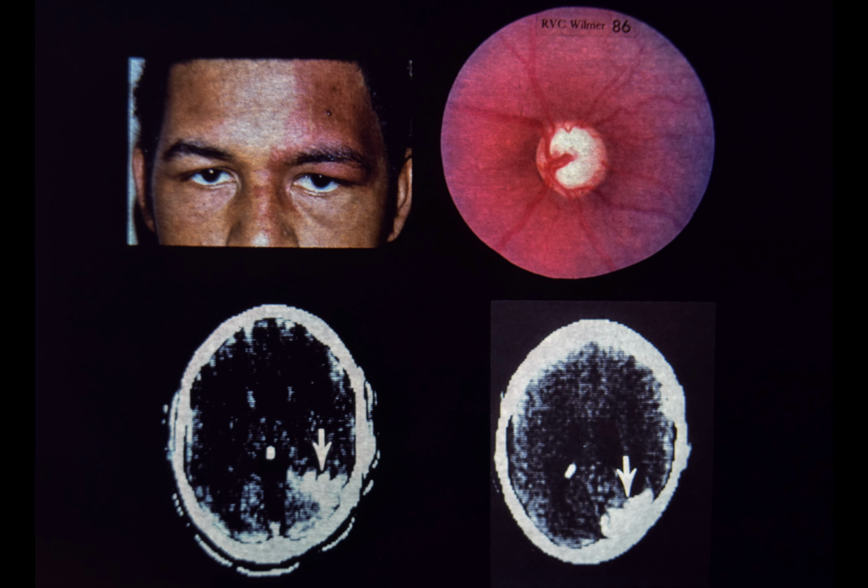There is a slight fullness to the left upper lid. Intraocular pressure is normal in the right eye and moderately elevated in the left eye. Upper right, the left optic disc shows extensive cupping with nasalization of retinal vessels, and the entire peripapillary fundus has a diffuse dusky red color.